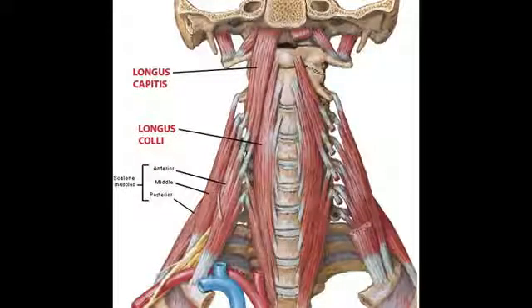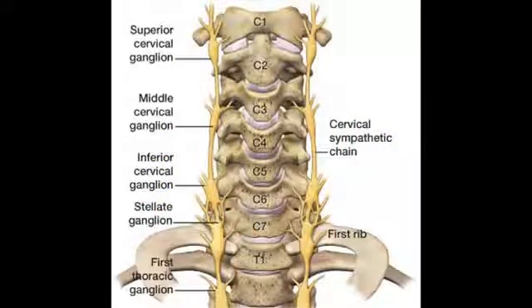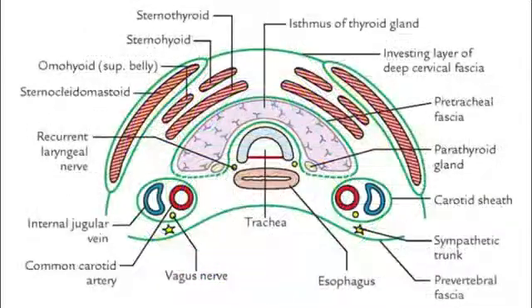Needle entry should always be in the midline to avoid injury of the major structures like nerves, vessels, and muscles. To enter into the cervical disc anteriorly, we have to push the trachea, esophagus, and thyroid gland to one side. The beauty of the anatomy is that pretracheal fascia is enclosing all the structures in its covering. Once we push the trachea, all the structures move together.